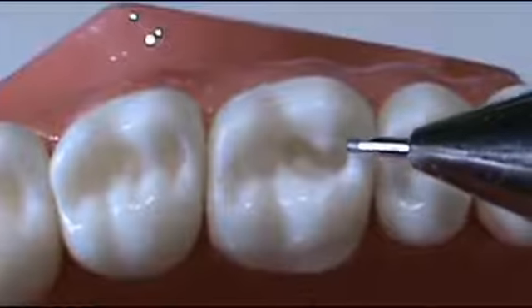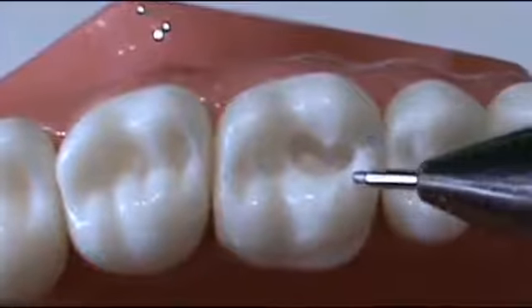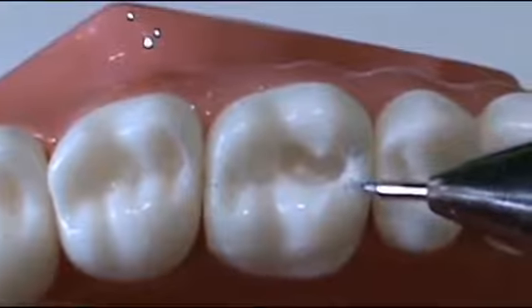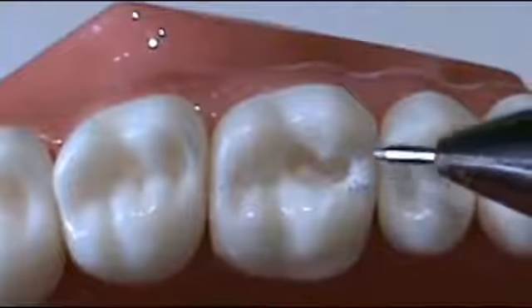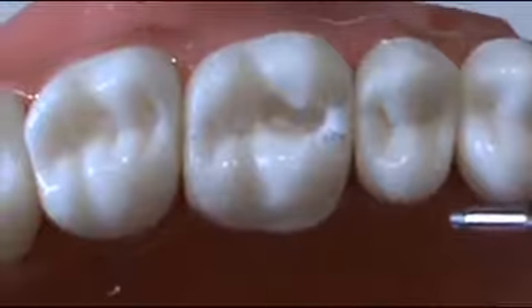After completion of the Class 1 cavity, this area of the tooth structure should be removed. In this figure, the mesial marginal ridge.